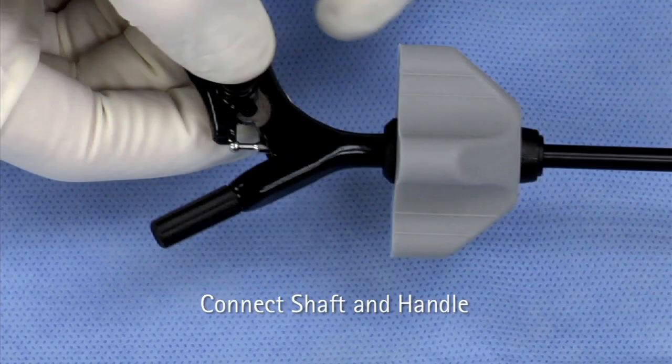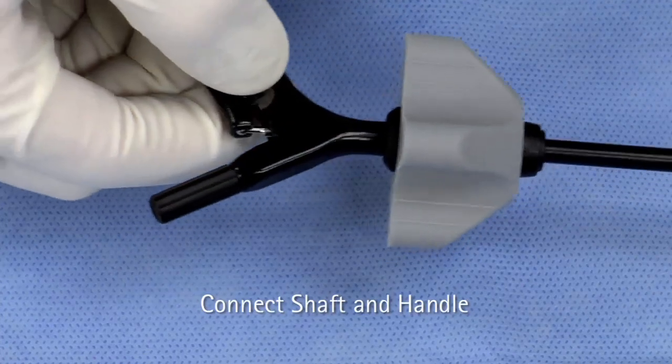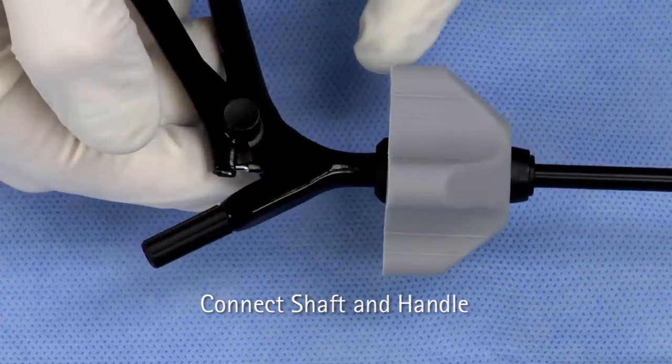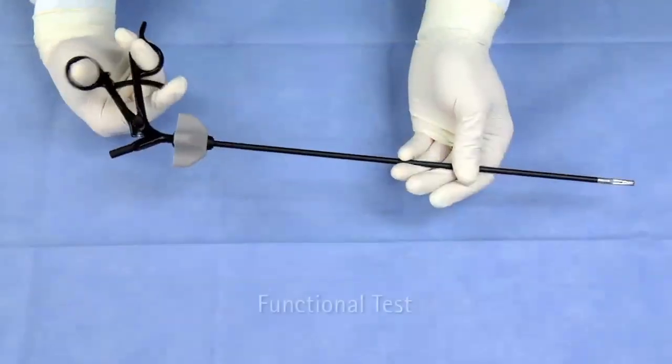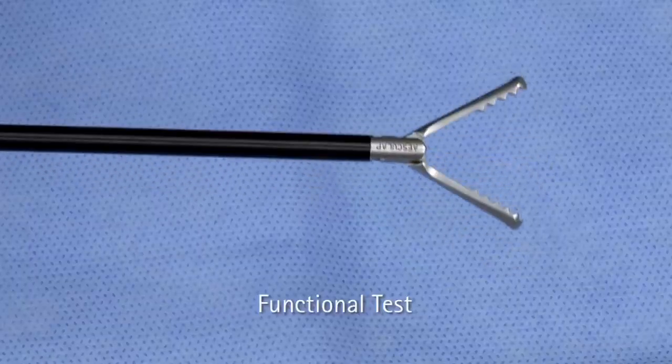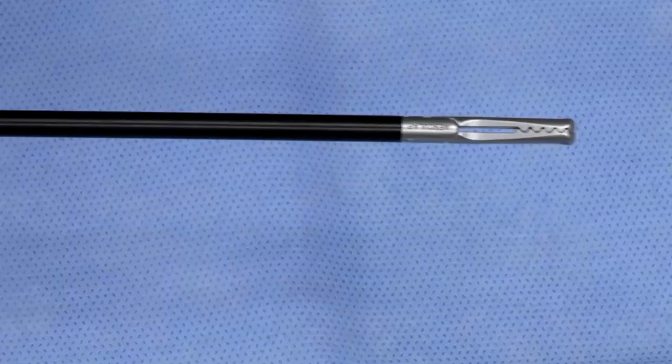Continue to depress and lift the rear ring of the handle under the ball joint of the jaw insert until captured by the handle. Release buttons. Test the assembly of the instrument by opening and closing the handle. This will ensure the jaw is opening and closing with the handle movement.